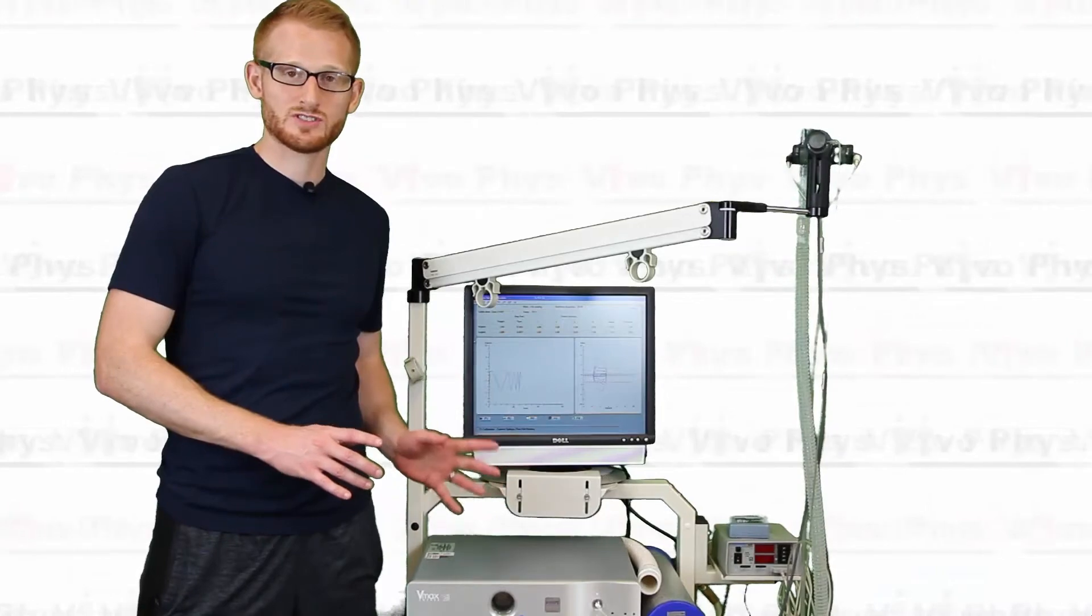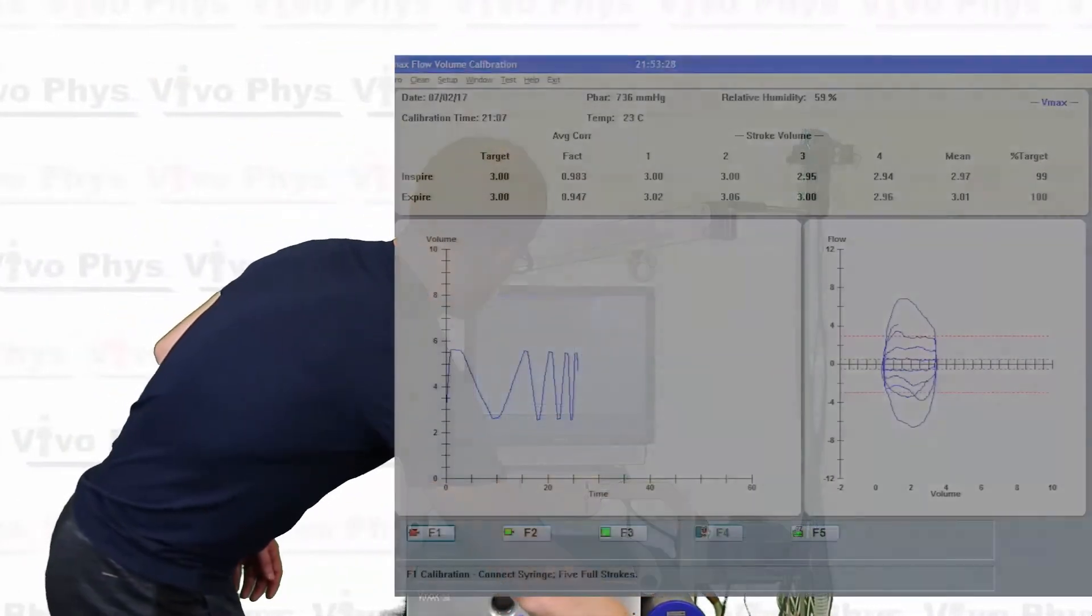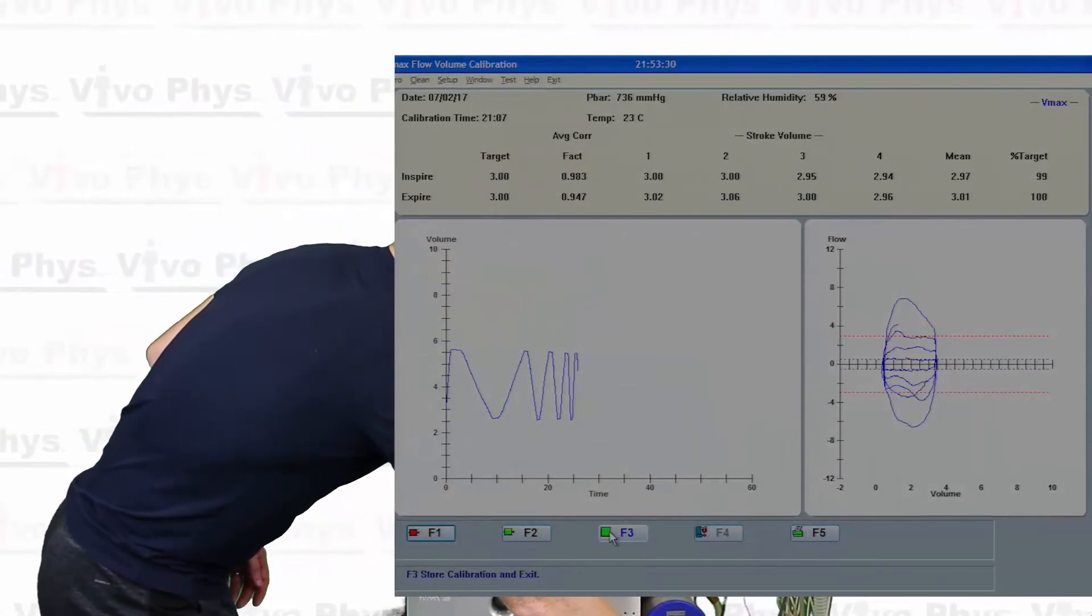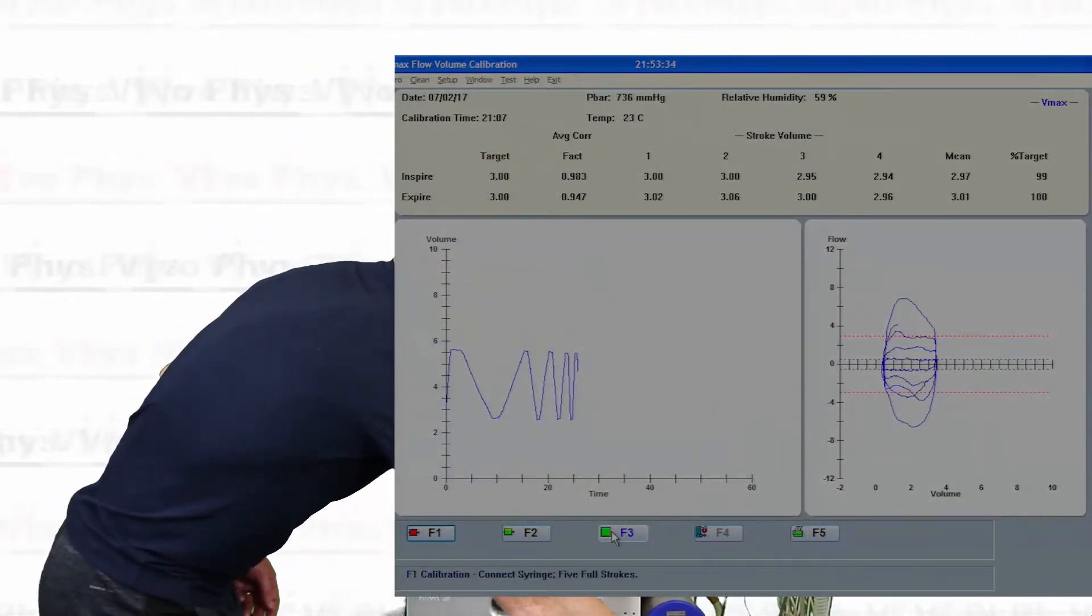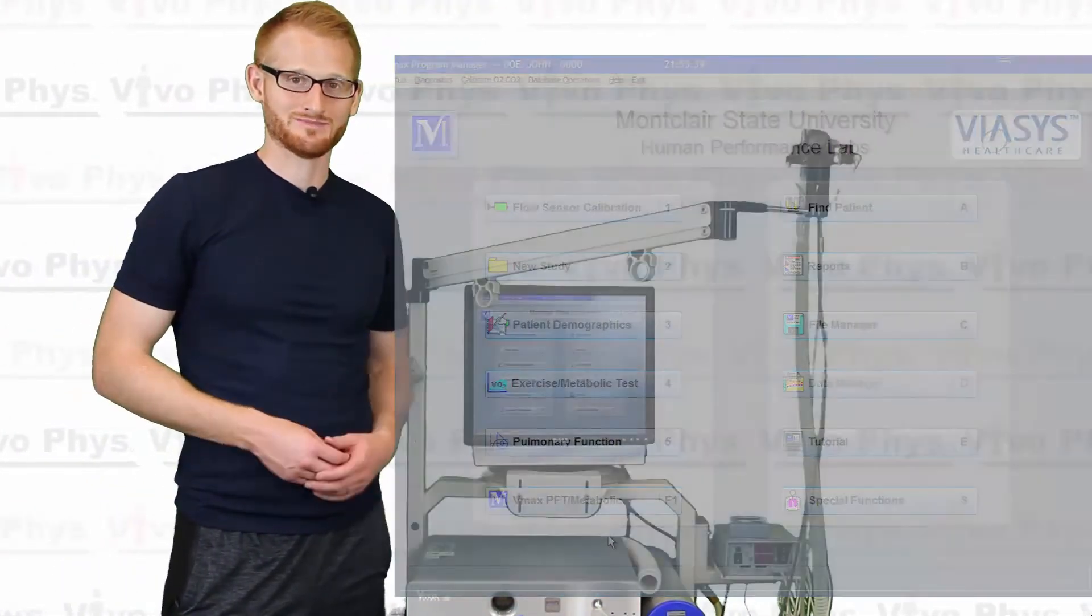Okay, so when you're all done with the flow calibration, the last thing you want to do is make sure you save it before you exit. So if you come down here, hover over these buttons, the one you're going to want is the one that says store calibration and exit. So you're just going to go ahead and click that and that's it. So flow calibration is done at that point.